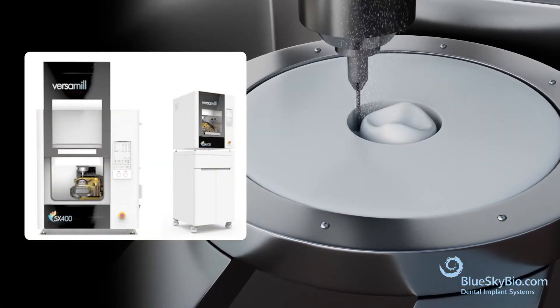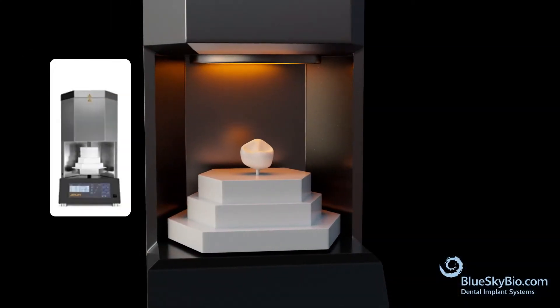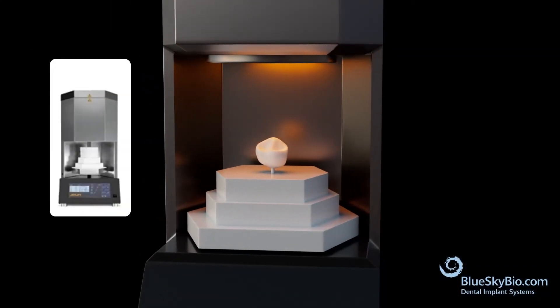The restoration can be designed in Exocad or Blue Skyplan. Once the restoration is milled, it is then placed in a furnace to be crystallized or sintered according to the manufacturer's instructions.